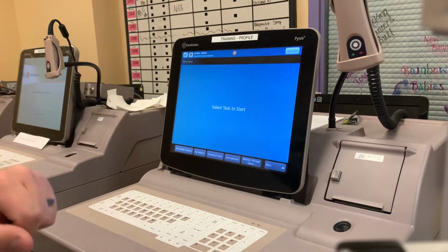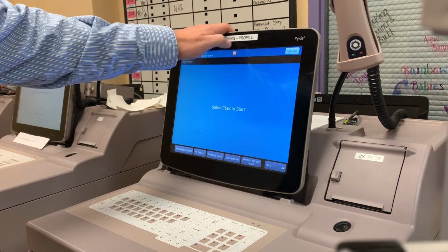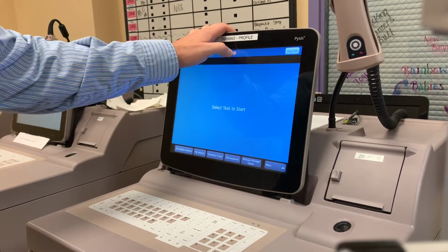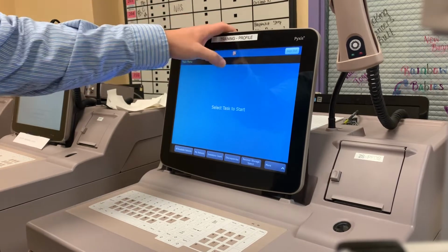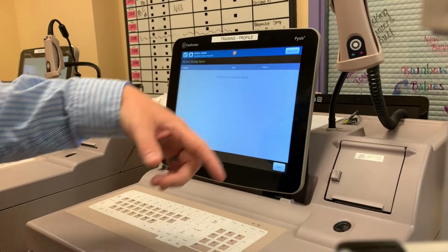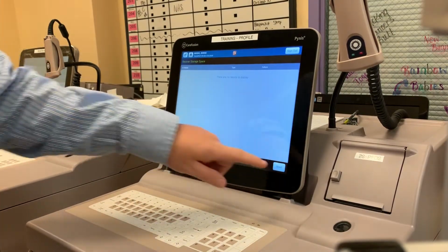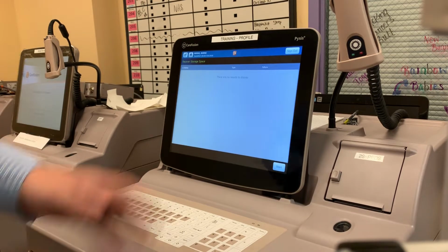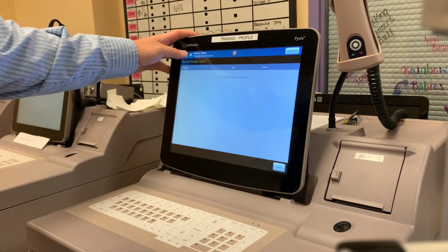This is your home screen. Orange at the top means something's wrong. It could be a failed drawer, in which case you would see an icon that said failed drawer. This one says discrepancies. But for one that said failed drawer, you would come down to recover storage space. It might say drawer 5. You would click drawer 5, hit start. It would pop out. You'd fix the little flap that wasn't closed or something like that, close the drawer, and it clears itself and it's happy.